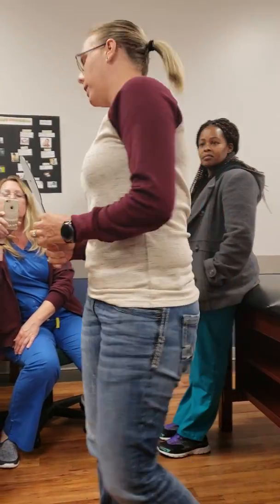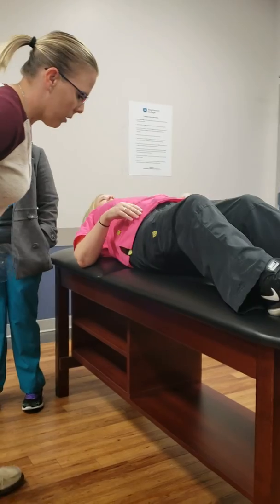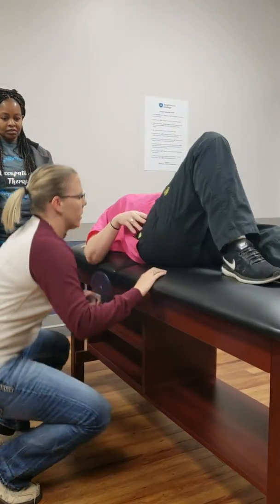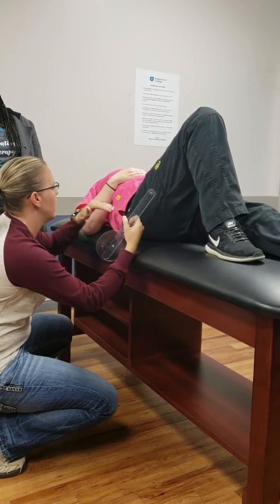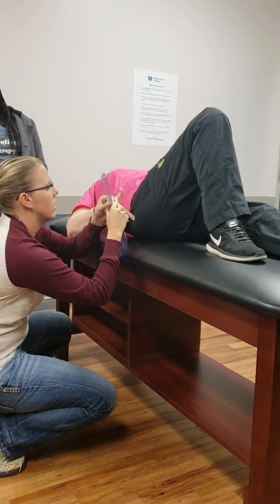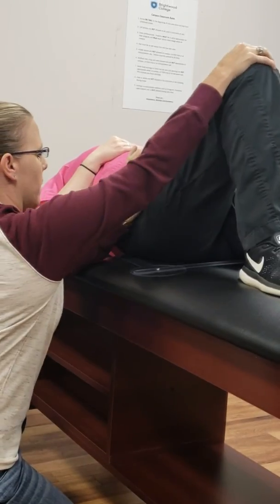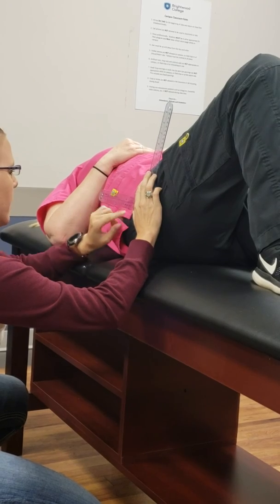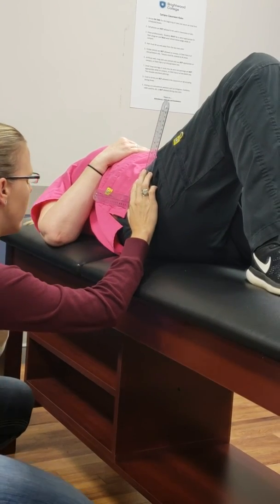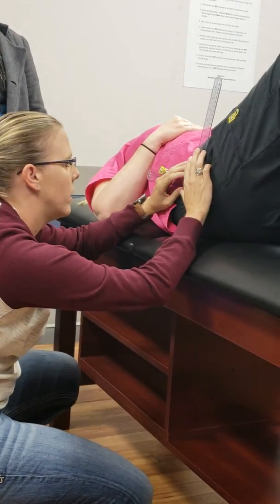All right. For the stationary, we're going to line it up. Go ahead, lay down. If we're going to bend your knee, if we're going to do hip, you've got the stationary lined up with the midline of the trunk, okay? And the greater trochanter, right there. So I'm lined up parallel to the midline of the trunk, or you can just say parallel with the table, whatever works for you guys.